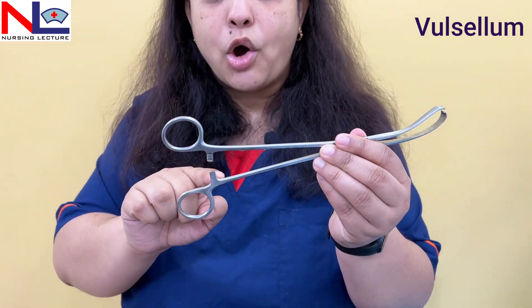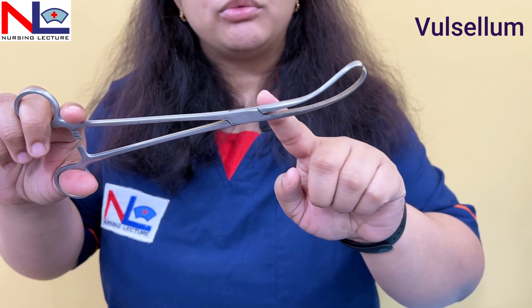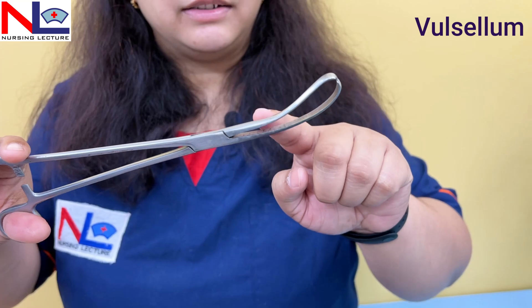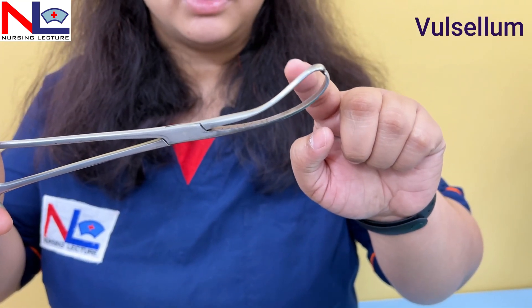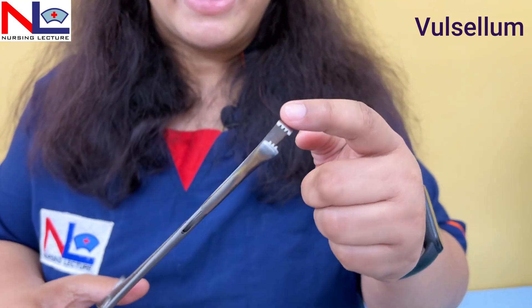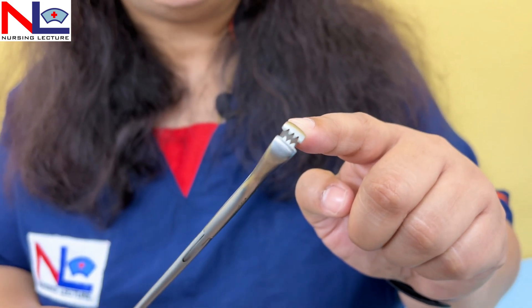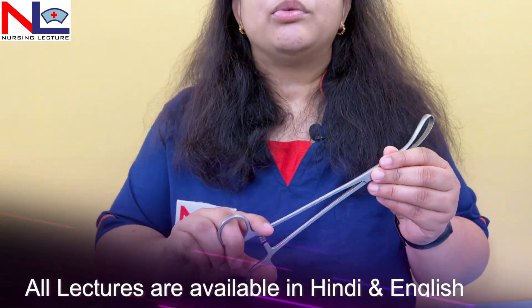First we'll look at the vulsellum. As you can see, a ratchet lock is present. The blades of this instrument are curved at an angle, and there is a gap or space between the two blades.